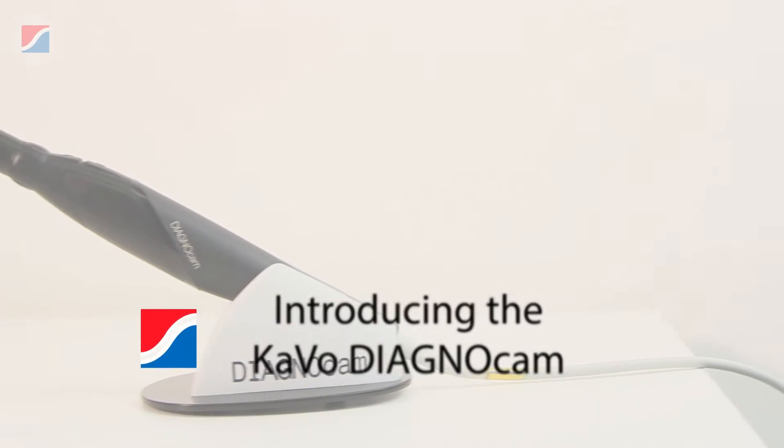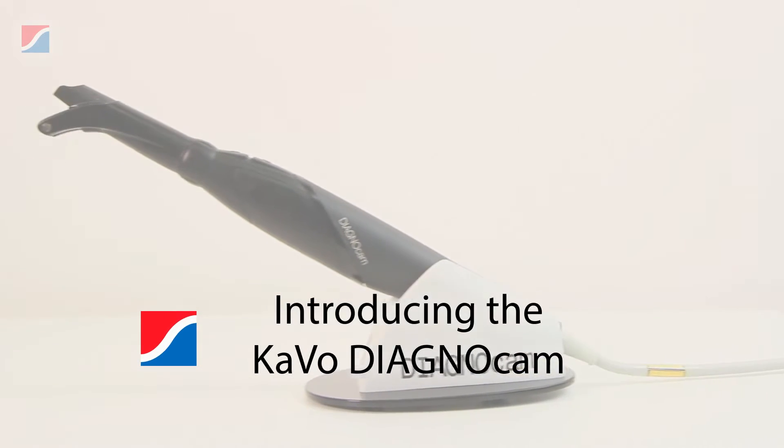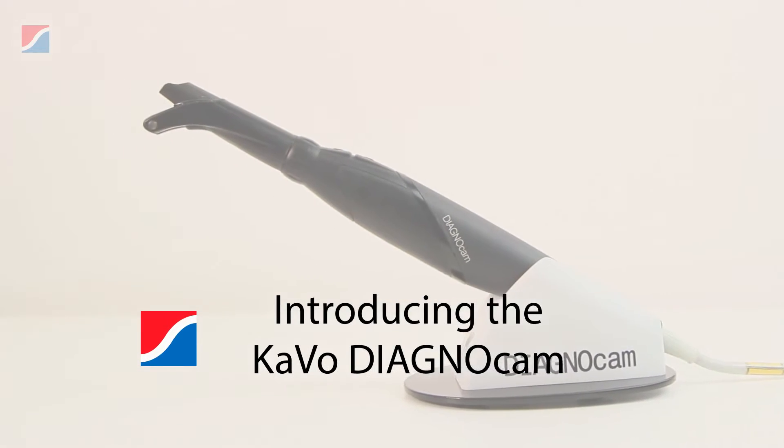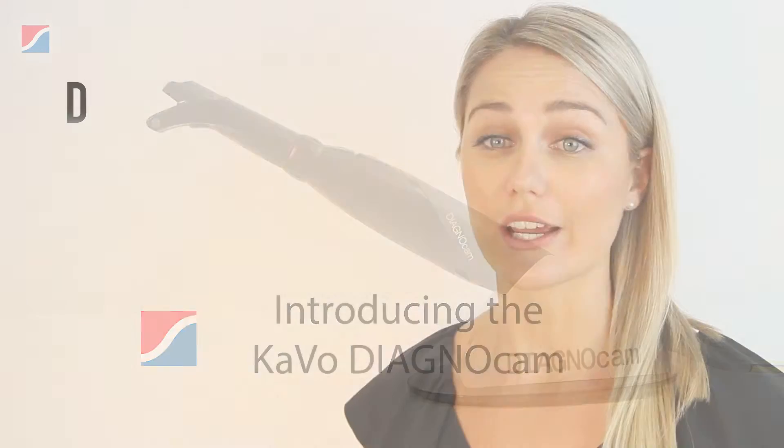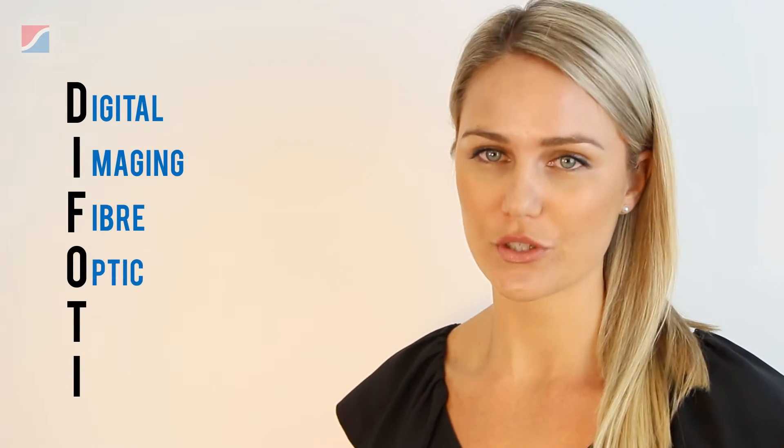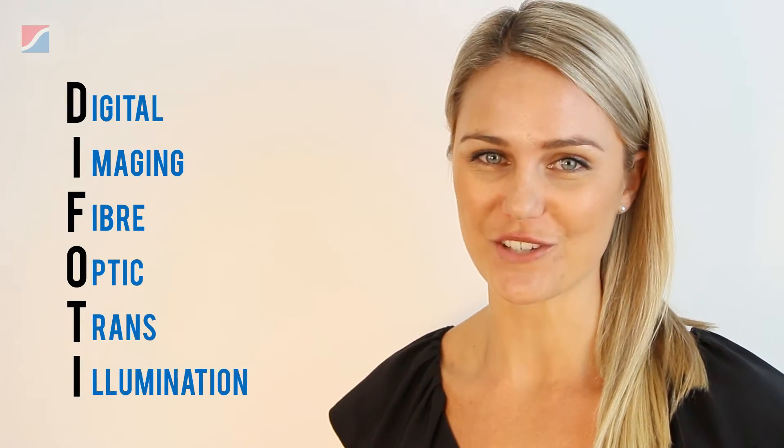The Kvo Diagnocam uses a well-known type of technology known as DIFOTI, which is Digital Imaging Fibro-Optic Transillumination.